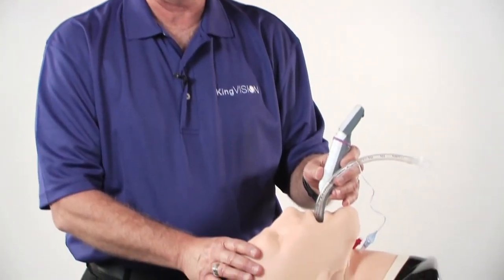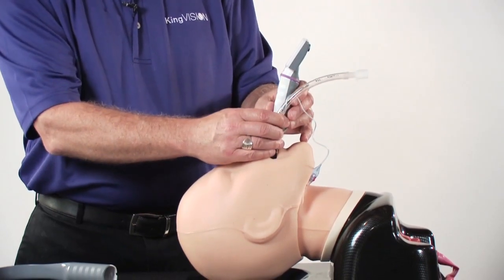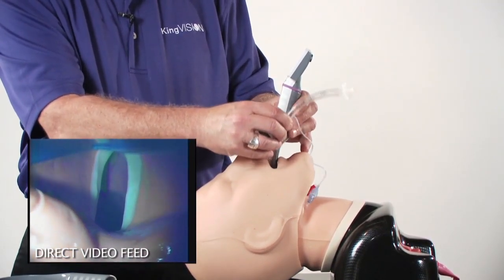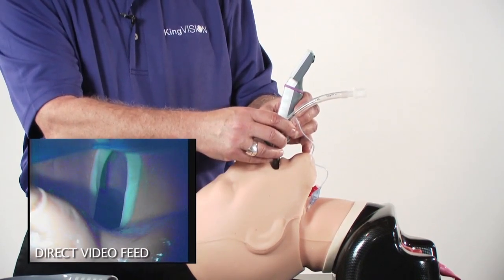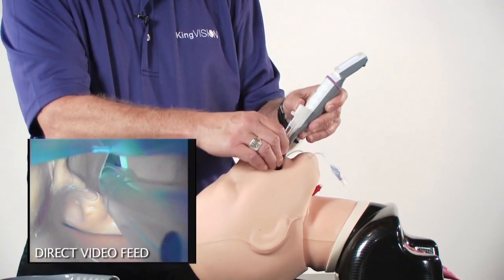It's very important with the King Vision Video Laryngoscope, like other video laryngoscopes, to not attempt to get a view that's too deep. The view of the vocal cords is up close and personal. What this accomplishes is you have a great view of the vocal cords, but the imaging sensor is in the way of the advancing tube, and you're typically going to run into the right border of the laryngeal inlet or the right arytenoid. If this occurs, be sure you back out and lift up a little bit before advancing the tube into position.